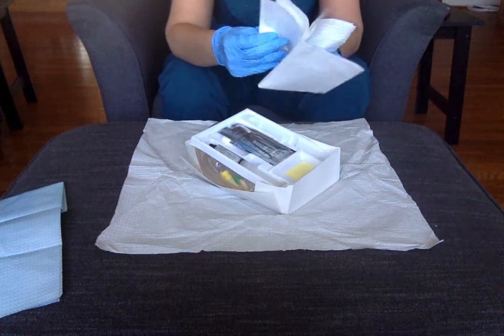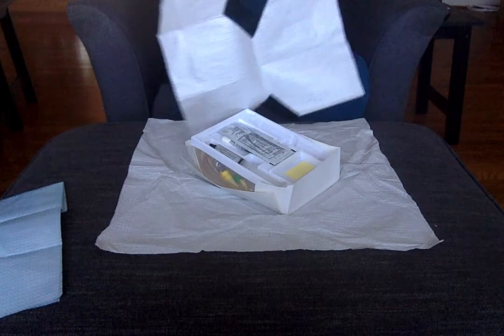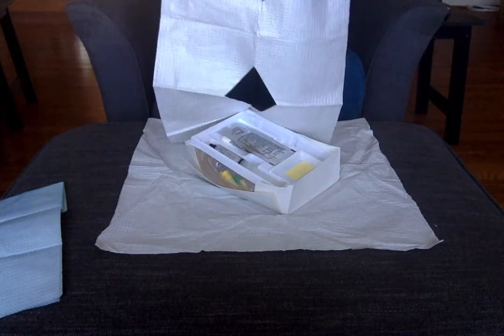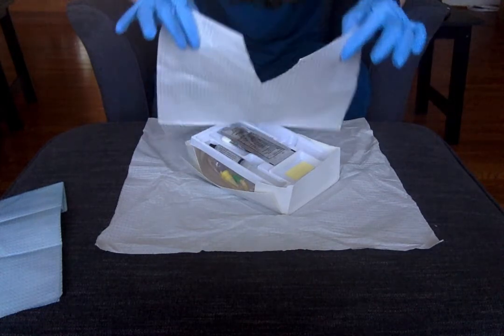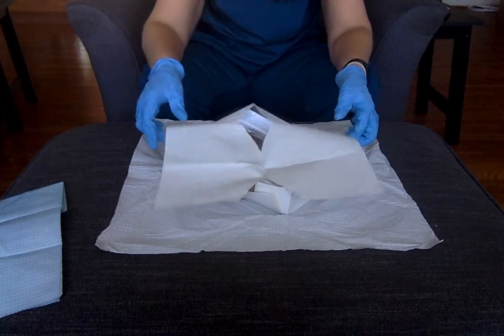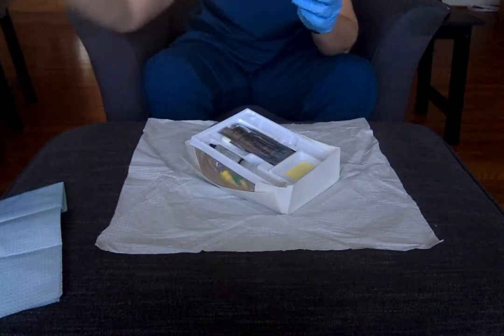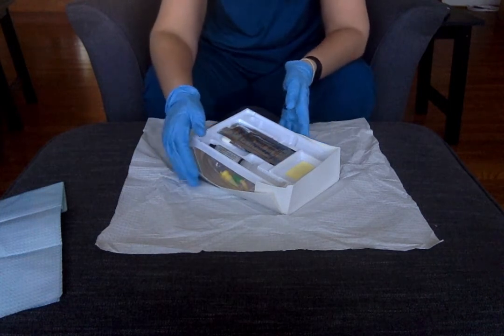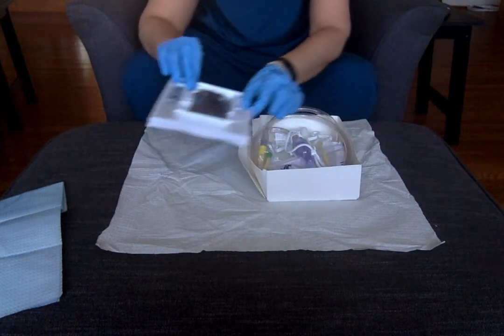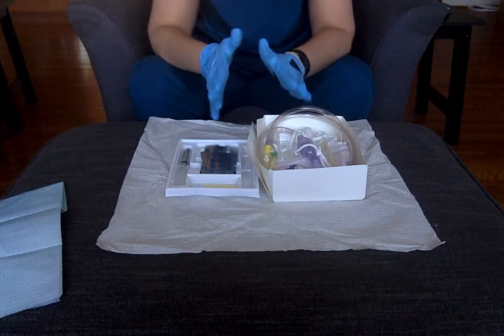This is your fenestrated drape. You don't have to do this in your checklist, but we use it to drape right over the patient's perineum. When you do this, because you're sterile, you're laying it down and letting it go — you don't want your hands to bump your patient. We're not going to use this today so I'm going to move it. Next I've got to set up my kit. Ours has a tray inside it, so I'm going to take this tray out and put it next to my kit — still on my sterile field though.